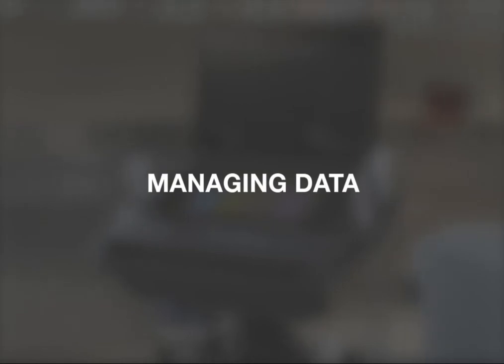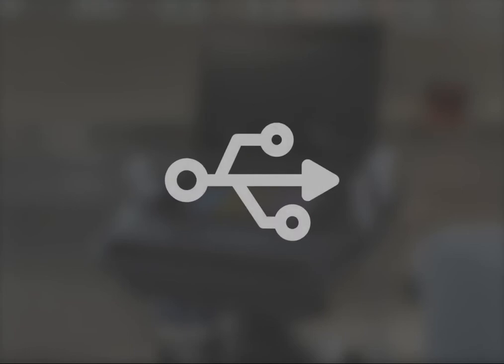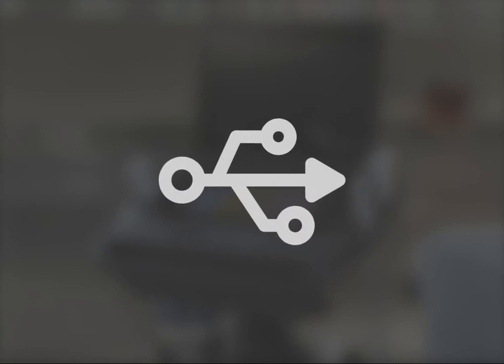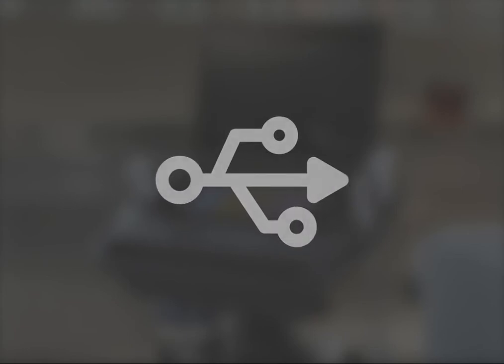To prevent data loss, we recommend you regularly export your data. You have a couple of options. You can export data to a USB storage device and then transfer your data to a computer.